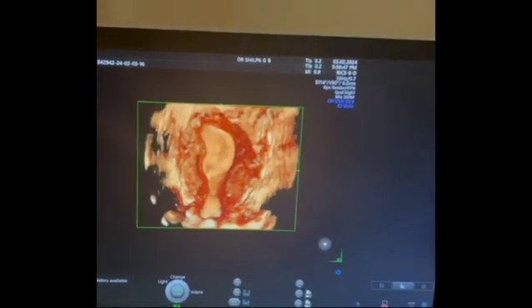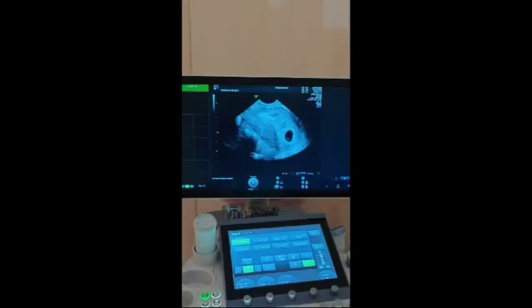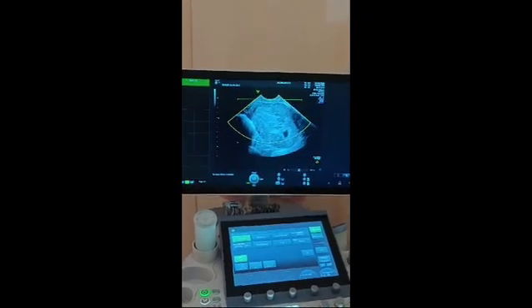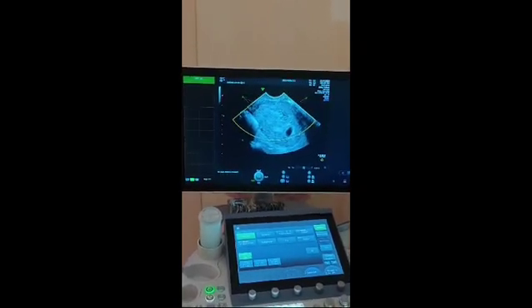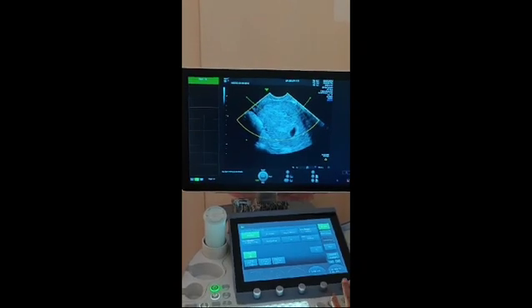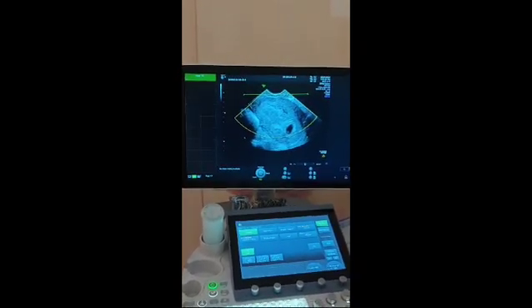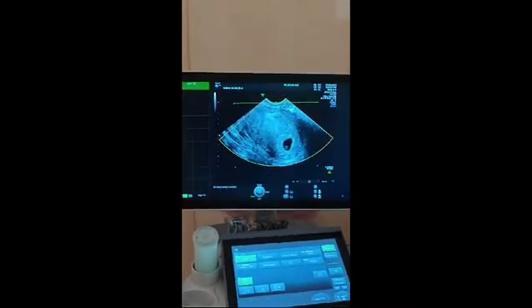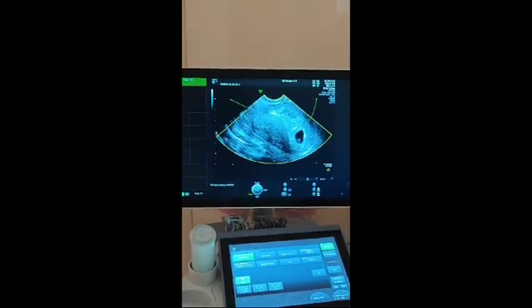You can see beautifully here the unicornate uterus, where the horn on the right side is developed and that side of the tube is patent. We went ahead with ovulation induction for this patient, and when the follicle came on the right side, we asked her to have timed intercourse.